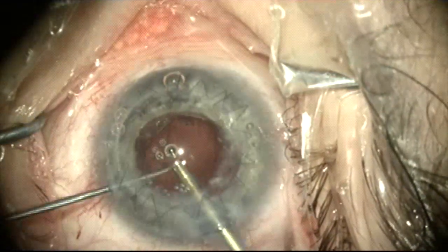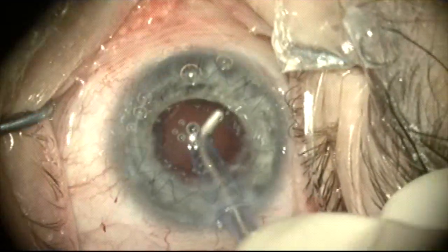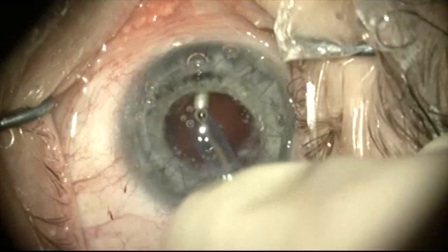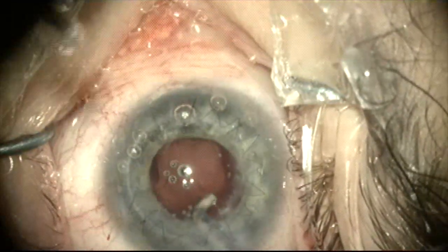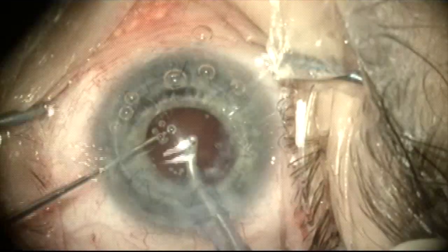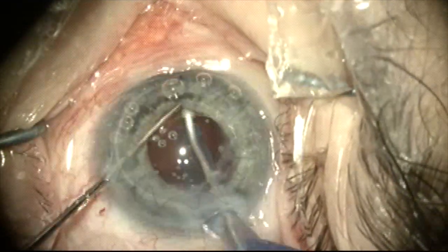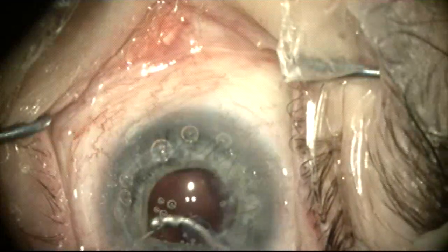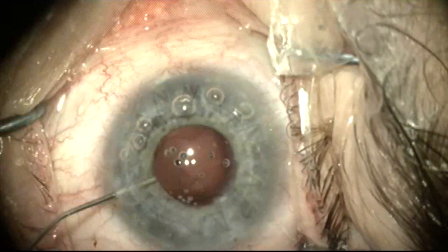After removal of the last nuclear fragment, irrigation and aspiration of cortex is carried out, and this goes rather routinely and smoothly as well. It is a bit difficult to visualize the anterior capsule rim because of the pupil coming down a bit. So a Kuglen hook is used to push the pupil out of the way so I can see the anterior capsule rim and vacuum under it, checking all areas of the bag to make sure there's no residual cortex.